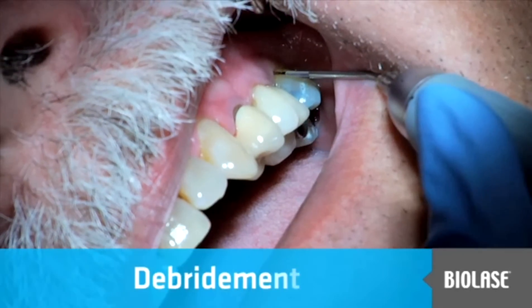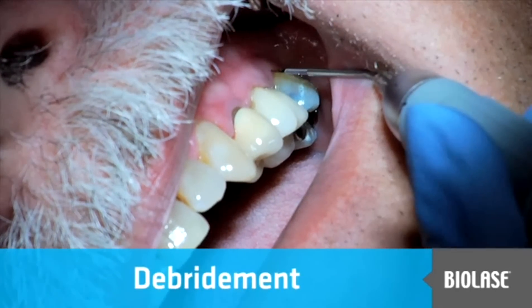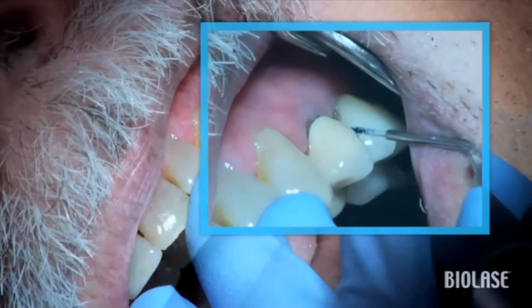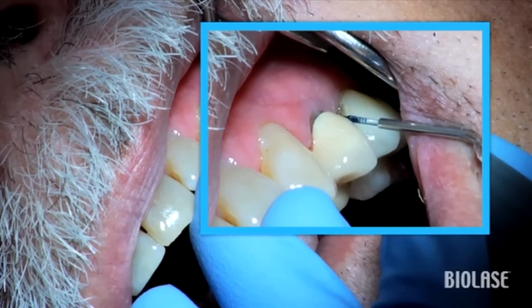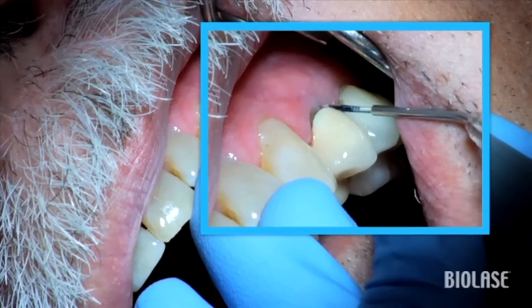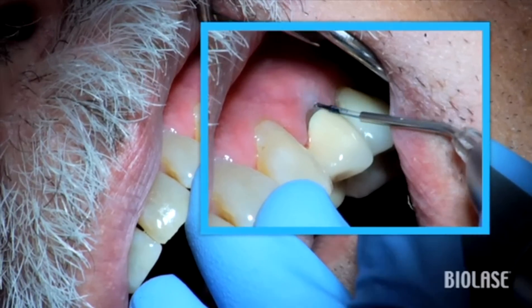For this procedure, Jennifer is using a 400-micron, 7-millimeter perio tip. The EyeLase is at the perio pocket preset on the CP2 pulse setting. The tip is initiated. The patient is fully scaled, root planed, and anesthetized.